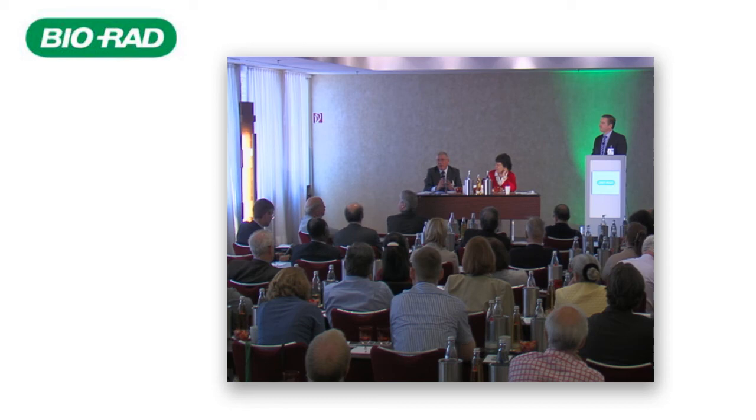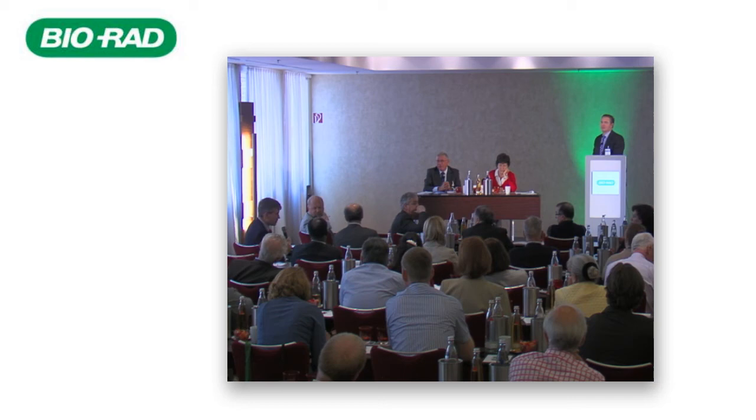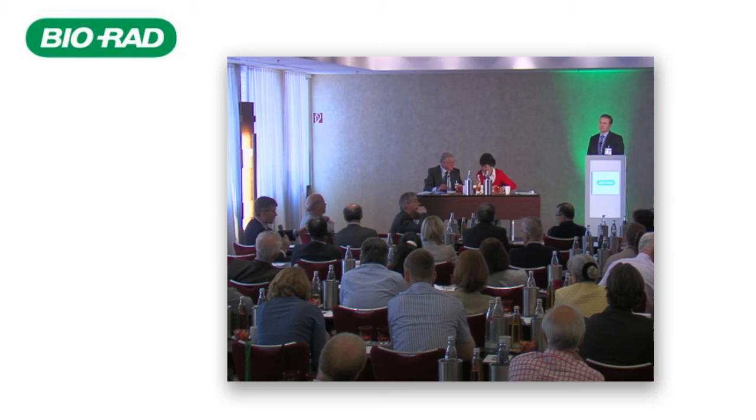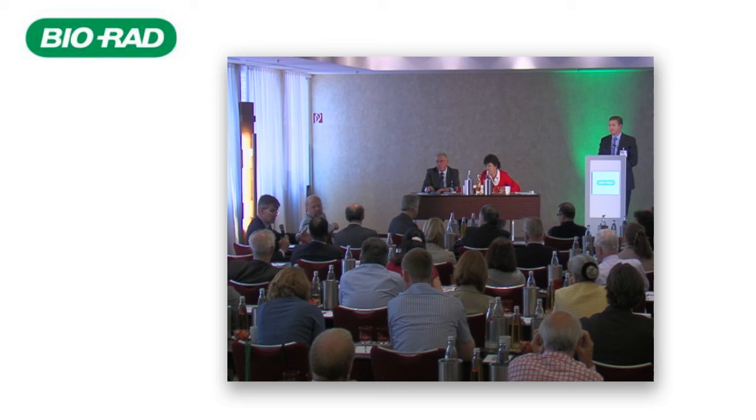I guess one of the other ways that we can influence it is by our purchasing decisions. I can certainly remember going through the performance of a whole bunch of analyzers against biological variation and choosing, and thinking very carefully about justifying that decision if there was a cost gradient. If we don't reward companies for producing more precise things, we let our finance people overrule us. Companies will respond to what we can buy. And in the end, it comes down to whether we really think it's important enough to have that low imprecision. And if so, we have to reward companies by doing it.